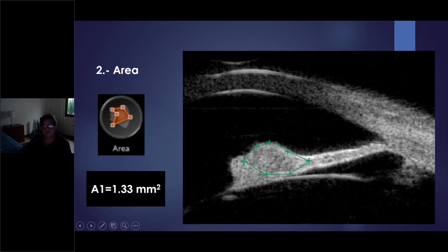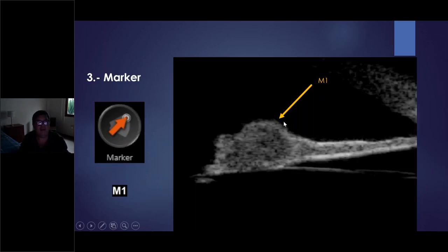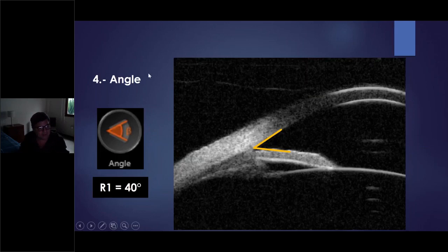And in the next examination, I can compare it and look if it has a growing of the lesion or not. Then I can mark a special part of the tumor. This is mobile. I can make the angle also, in this case 40, it's an open angle. They are very interesting tools that you can interact with your images.